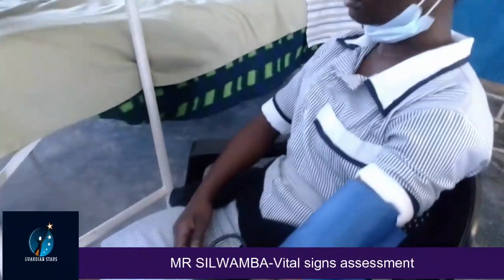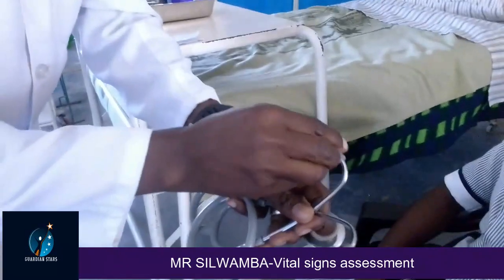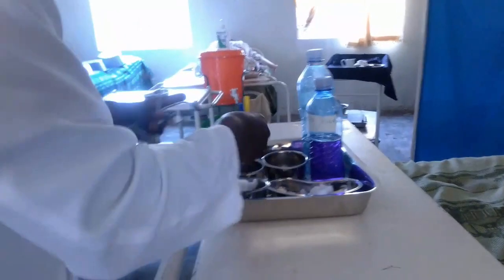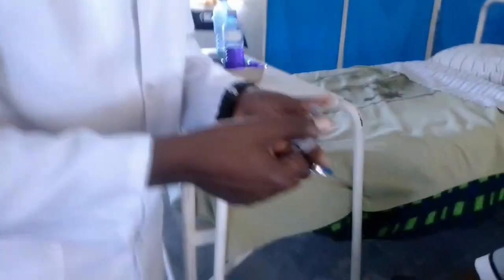So now get your stethoscope. Before using the stethoscope, you need to clean the earbuds with spirit. So you need to go there. One swab, you throw. Then another swab, this other side, you throw. So meaning at least it's safe to use. And I can put it right there.